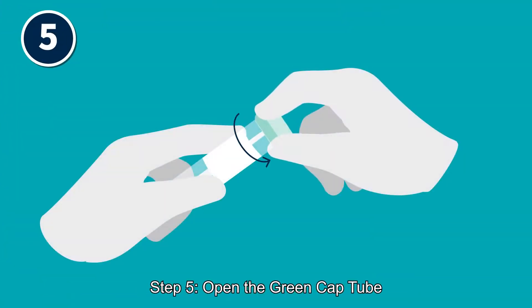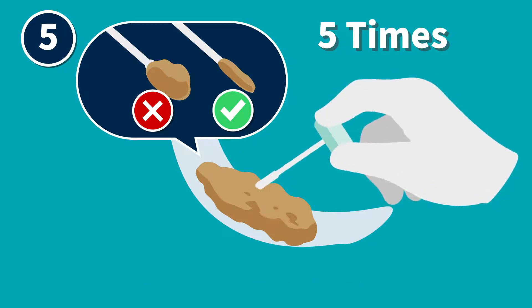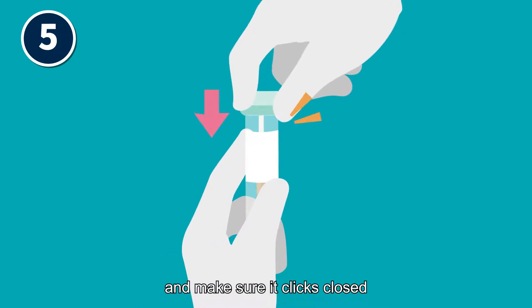Step 5: Open the green cap tube. Scrape the stool surface from side to side for 5 times with the sampling probe. Insert the probe back to the tube and make sure it clicks closed.